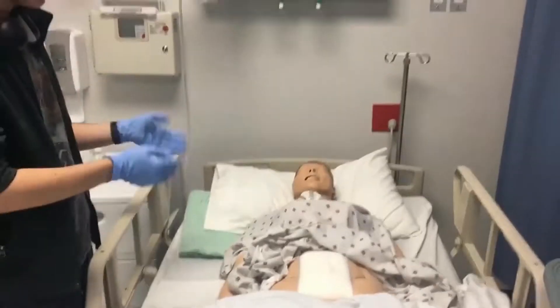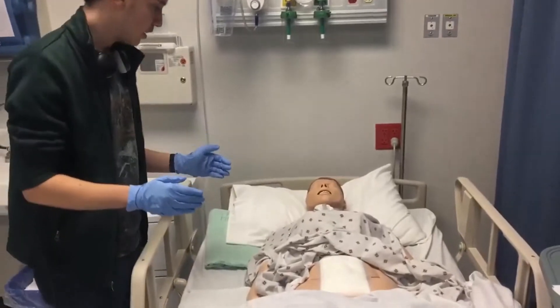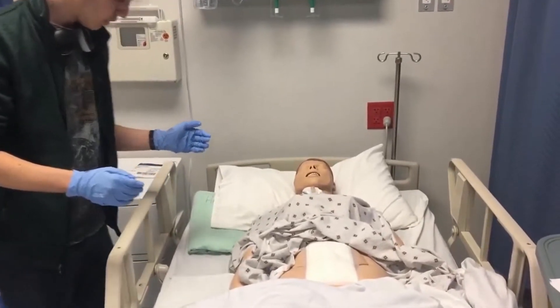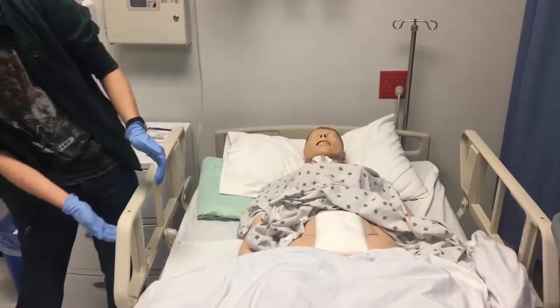Make sure the patient is in a comfortable position. I've only covered as much as I need to in order to maintain the dignity. I'm also going to need to make sure that the patient is in a good position for me to be able to access the area and also at a good working height.